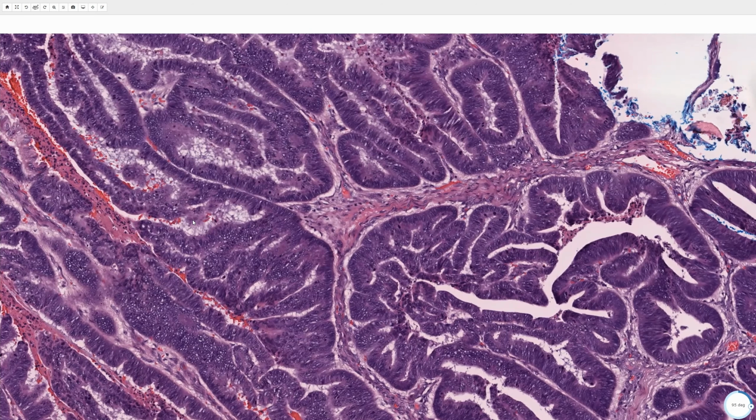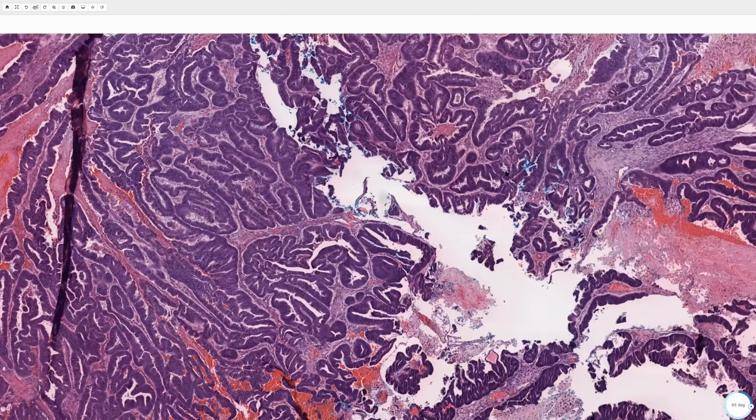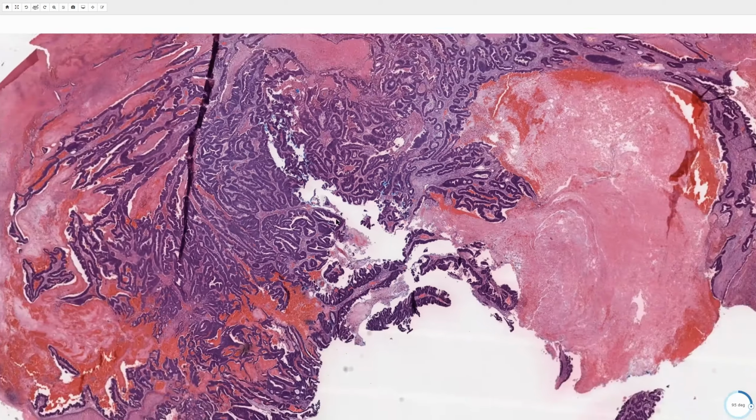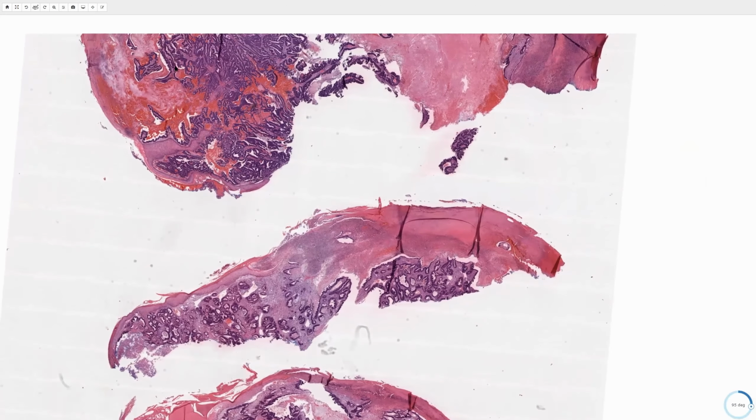You may see signet ring cells, and the glandular elements in the dermis can have these neutrophilic abscesses in the lumina. These are typically going to be cytokeratin 20 positive. So again, below the diaphragm, CK20 positive. Another newer marker is CDX2, and these will be villin positive. So think of villi and these little projections, and villin will stain these. Here's some nice example of that secretory material. Sometimes you'll see these periumbilical or on the abdomen, but usually a poor prognostic indicator for these patients.